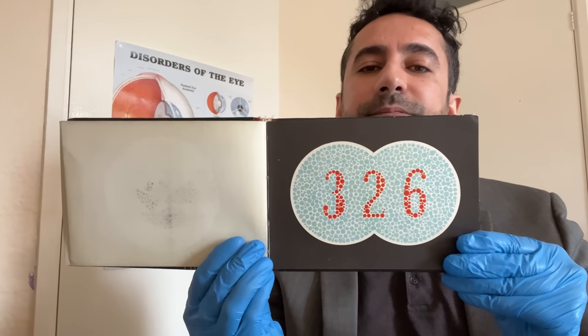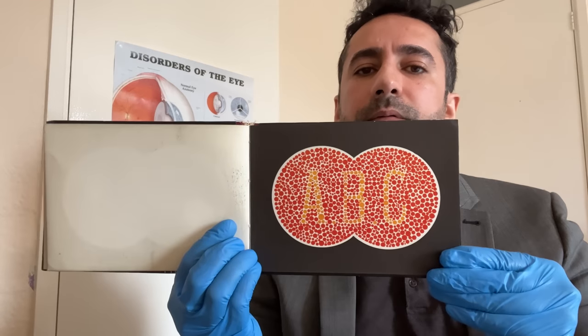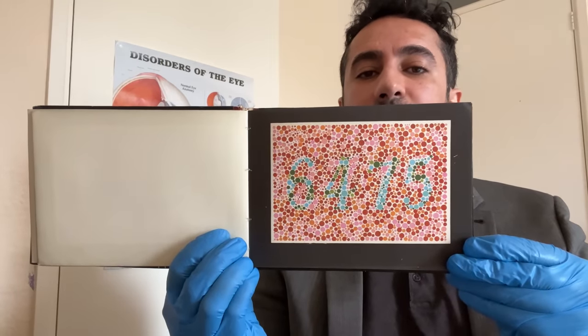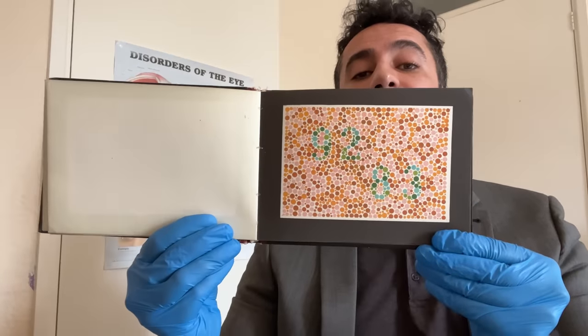It's a beautiful picture there, isn't it? You'll find this test very interesting indeed — certainly a colour vision test you may not have seen before. Can you see that please? We have a double set of numerals on this plate for you to identify.